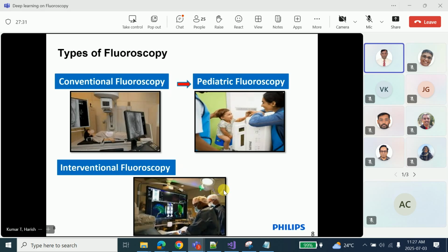That is not relevant for every patient to be the same. These parameters can be changed for every single patient. It is not a default or a set protocol that we always need to follow. When a patient walks in, that's why the history of the patient is very important for the technologist, for the physician who's taking the patient inside. What are you looking for? What is the history? That is how you plan your study.